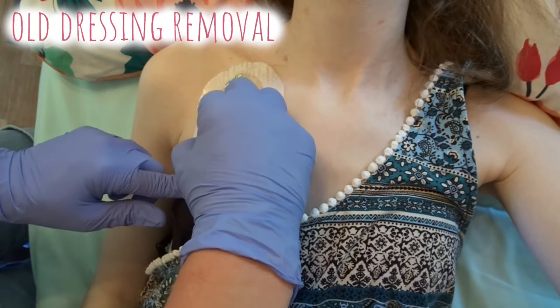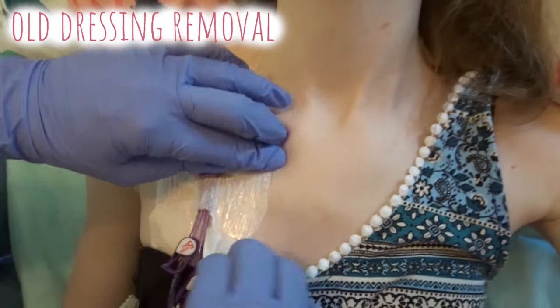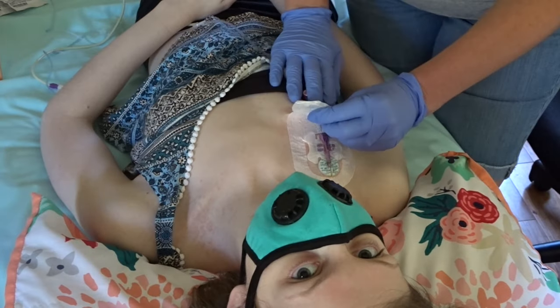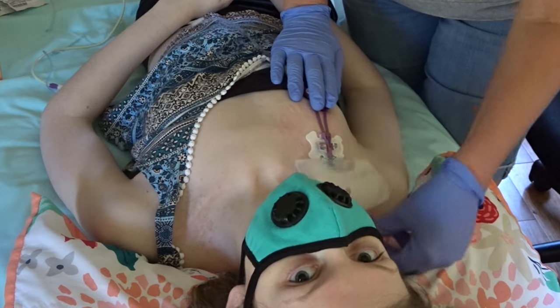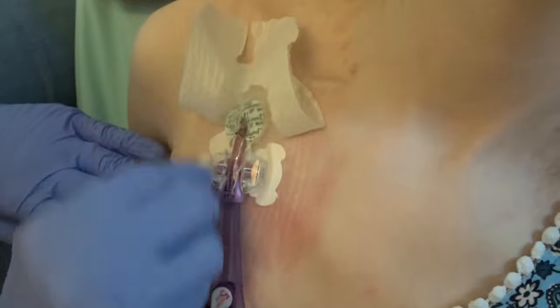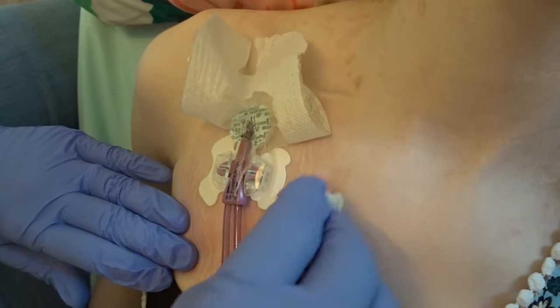The next step, still with the non-sterile gloves, is to remove the old dressing. If there is a bio patch or a stat lock, you will want to remove those as well. If the adhesive is extra sticky, rubbing the edges of the old dressing with alcohol helps it come off easier.